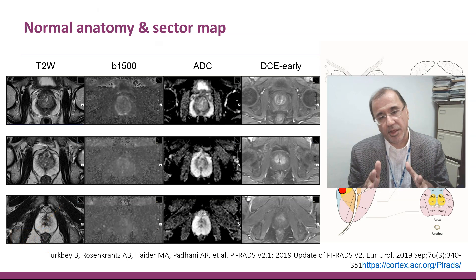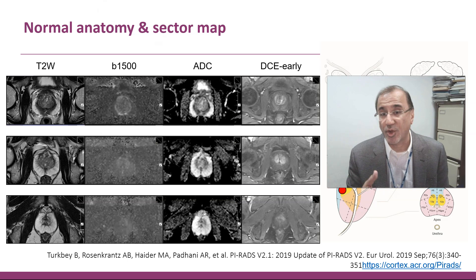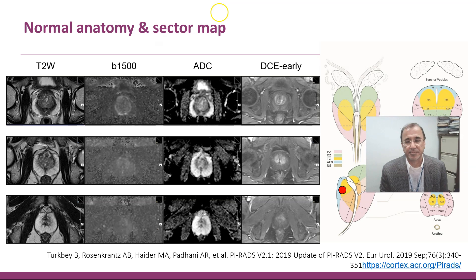These anatomical structures are best seen on the T2 sequence. On other images of the multiparametric MRI you may not be able to see all these tissues. You can tell the difference between the peripheral zone, central zone, and transition zone on an ADC map, but you don't see the same differentiation on the high B-value images.